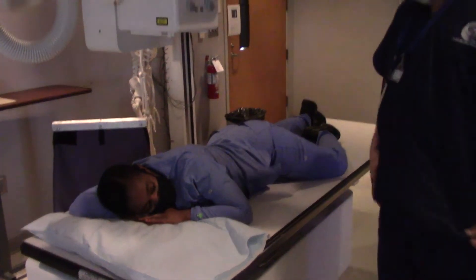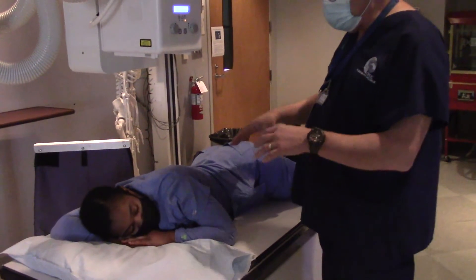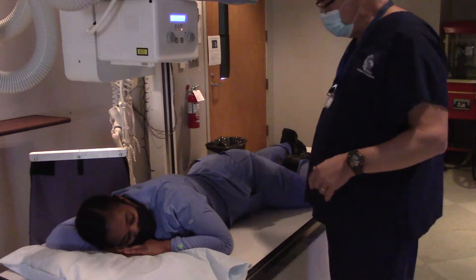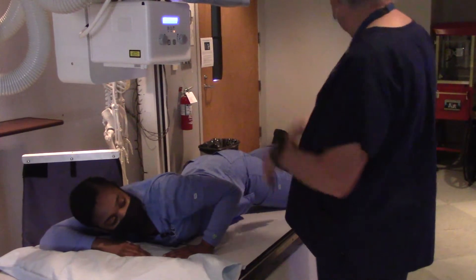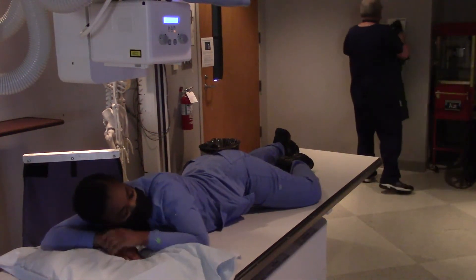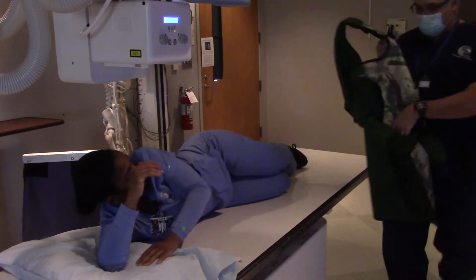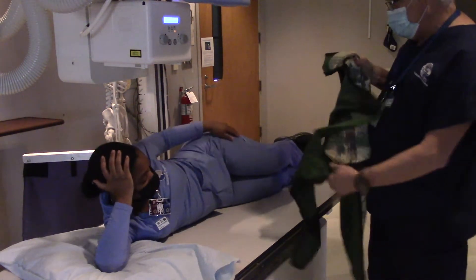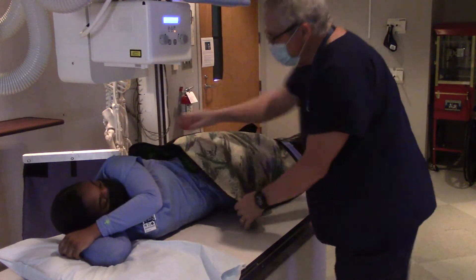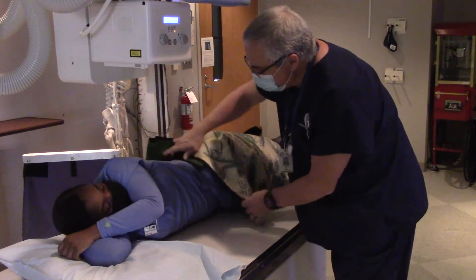Okay, super. All right, now my next image. What I need to do is get this patient to roll into a right lateral position. Okay, let me go ahead and get a shield for you. Ordinarily I wouldn't throw a whole apron over my patient, but that's the only shield I've got. So there we go — that might be a little heavy for you, but hopefully that's not too uncomfortable.